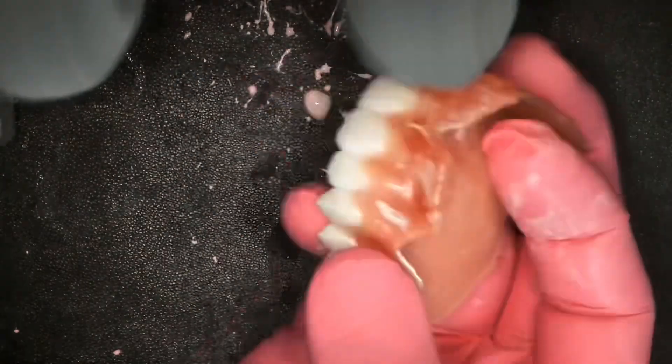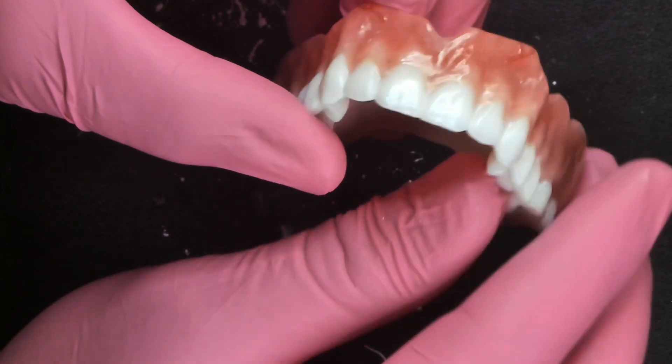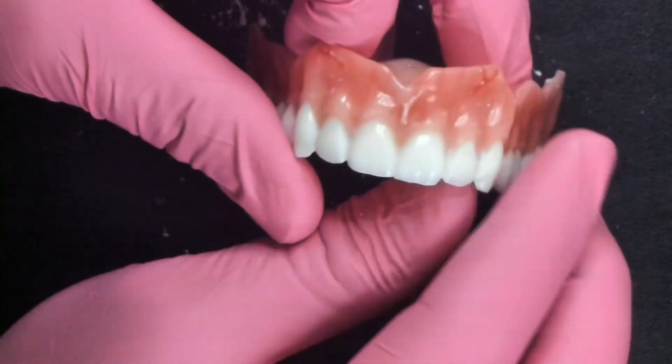Here I'm using the custom lathe from the Mod Institute, but you could also use an ultra fine thread count cotton buff with nothing on it. This is how it should look when you are done polishing — it should look wet and shiny.